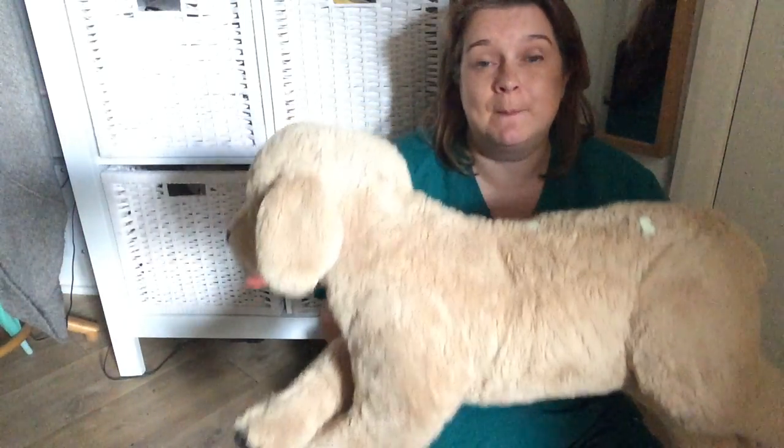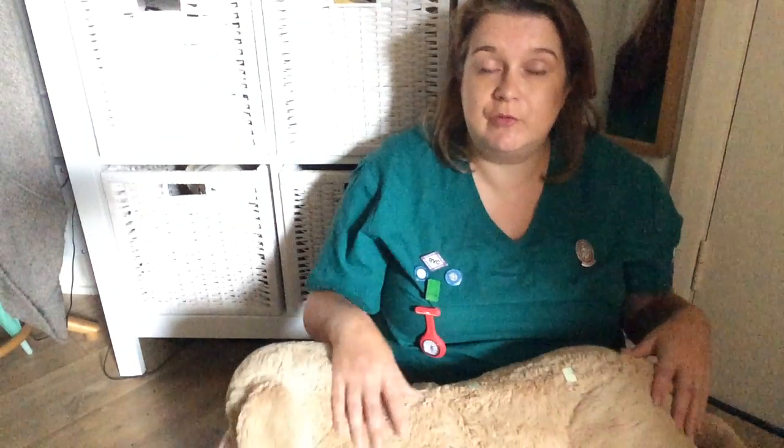Hi, it's Jane, R.V.N., and we're back in the semi-darkened room to look at some imaging. This time I'm going to show you how to find the landmarks for the cystogram. The cystogram is taking a lateral x-ray of the caudal abdomen.